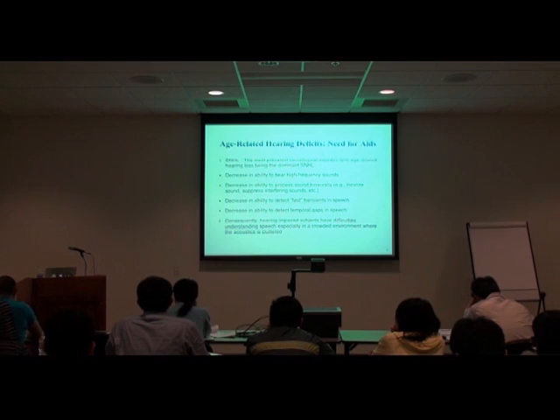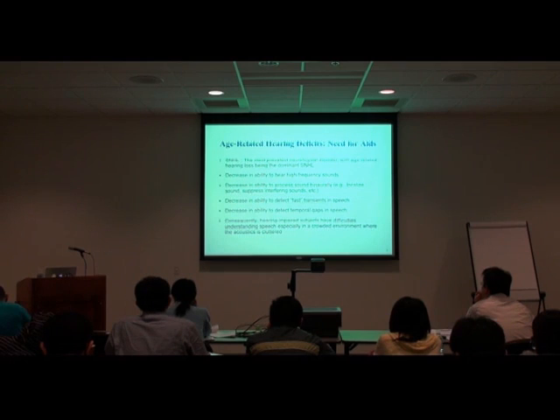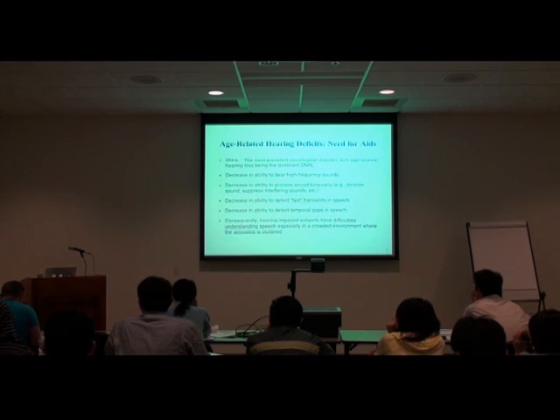Well, due to a number of factors. One is the cost. It costs a minimum of $1,500, and it ranges up to $6,000 to $7,000 per hearing aid. It's not covered by insurance, and it has stigma, because if Casey or I were wearing one, you can really tell that I'm probably 60 years old or older. I don't like to do it. So there are a number of problems.